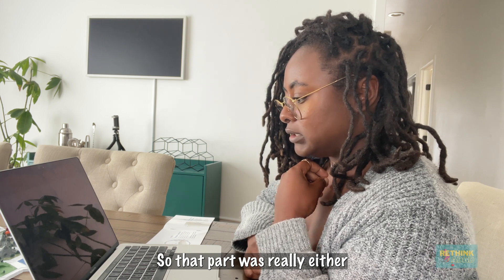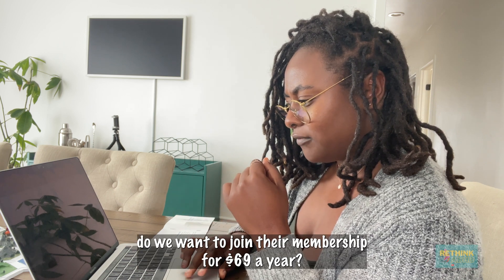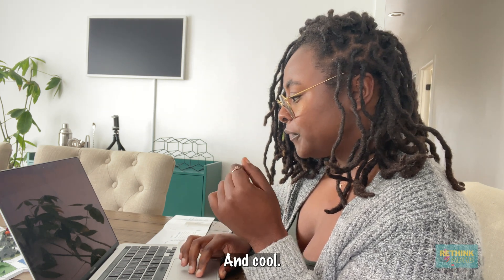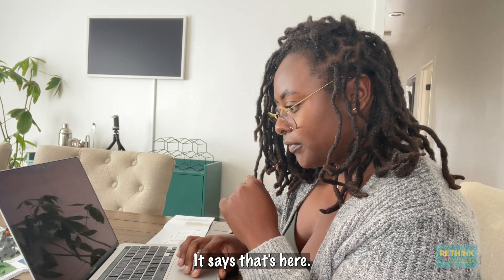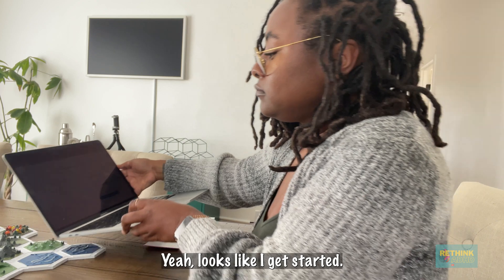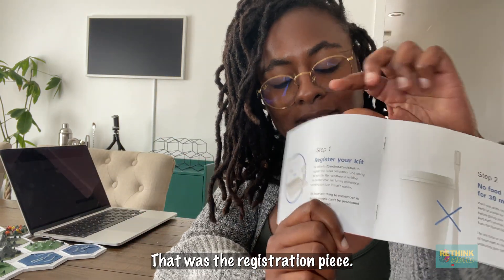That part was really easy. There's a thing about joining their membership for $69 a year — no thank you. Now that the kit has been registered, it says get started. So we've done step one — that was the registration piece. We're going to go to step two.